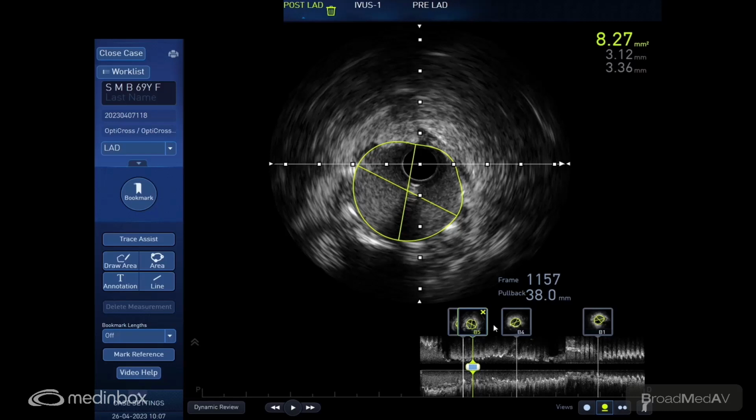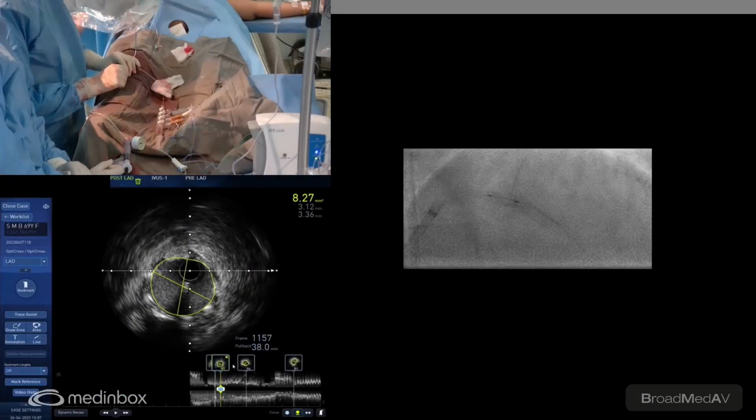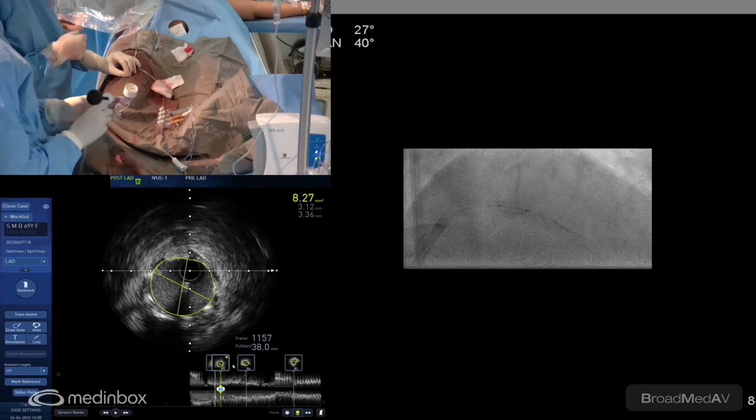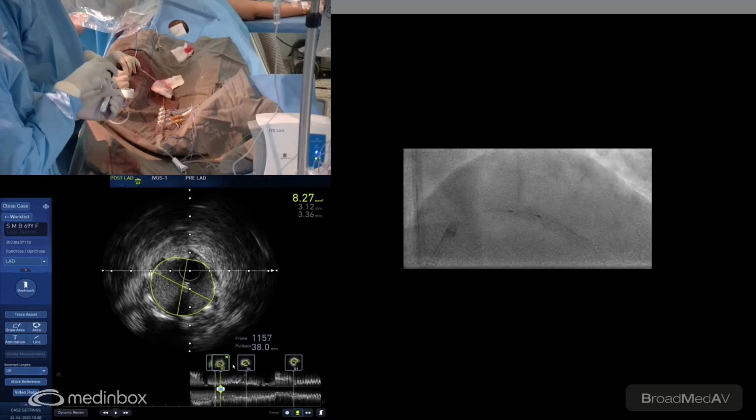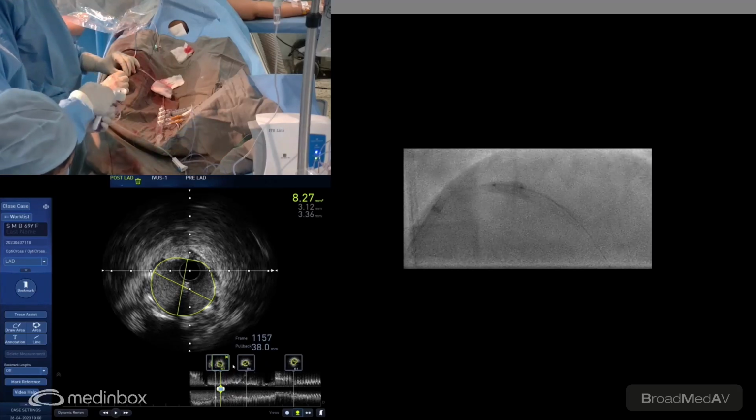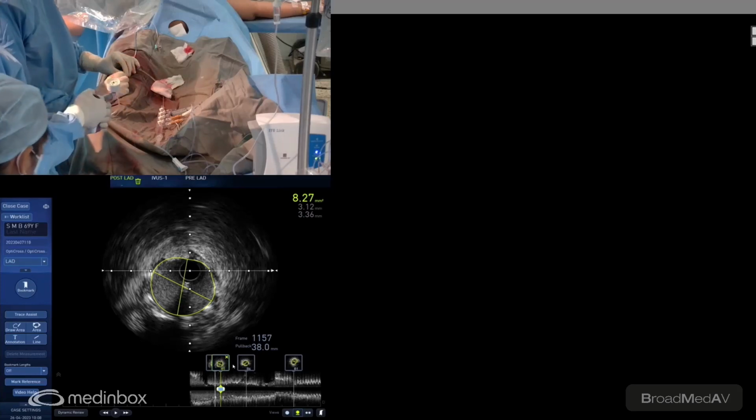So here we shall use a stent boost. Yeah, I'm going to use a boost again to just be sure that we're not outside the left main LAD stent. Okay, can come back a bit. Yes, I think only the proximal, because beyond the proximal segment, the area is good. Go ahead, go up to 20. So this is just to optimize the proximal. We're going to 20, 3.5.